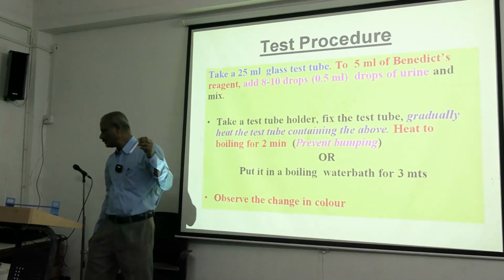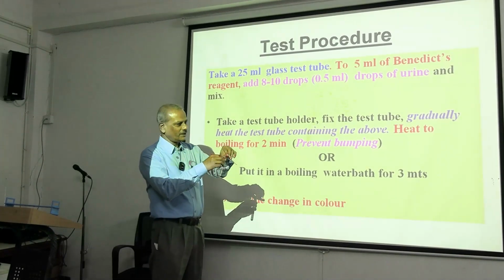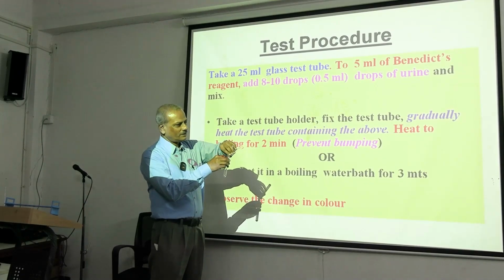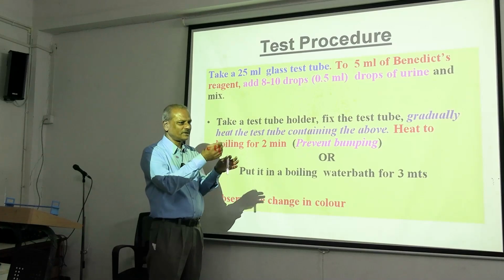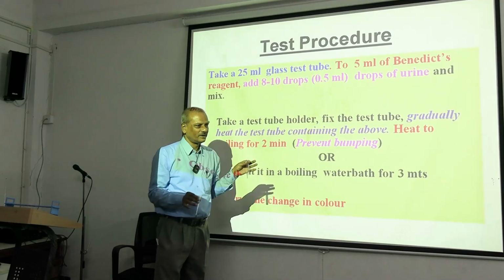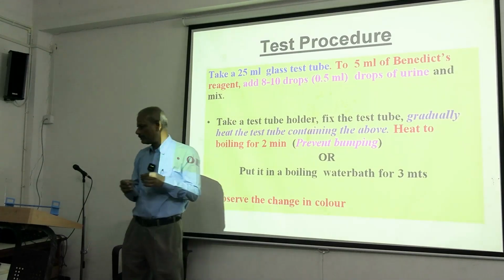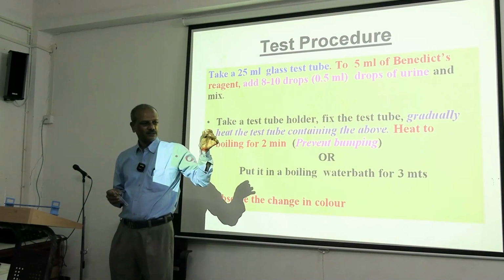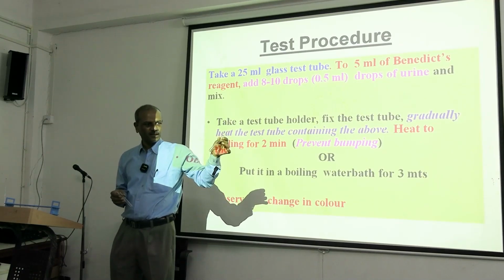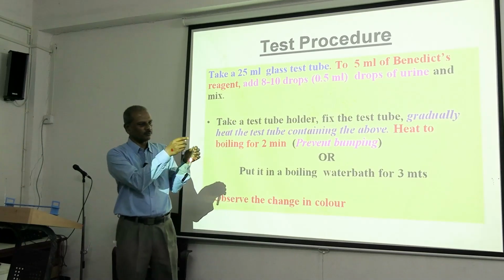Otherwise, you can take a separate test tube if it is available. Very carefully put it down and mix it at least 2 times, because otherwise everything is not mixed properly. That is the best method, which I prefer. But if that is not available, then go on constantly shaking it, wait a little bit, then shake again, at 5-second intervals. But no solution should come out of the test tube.